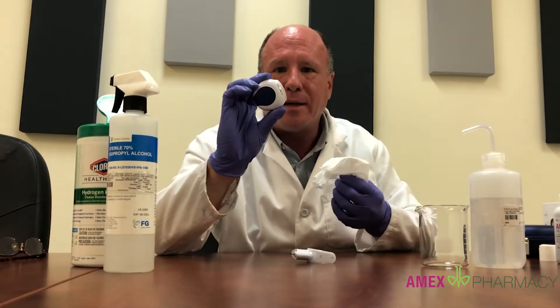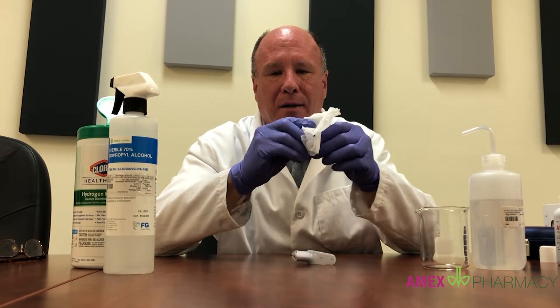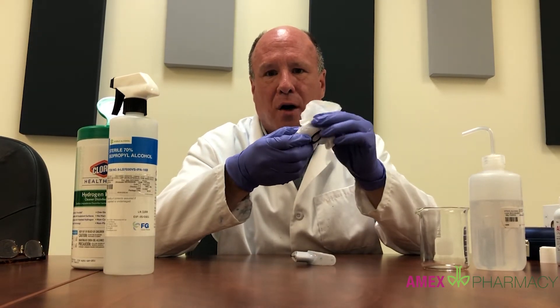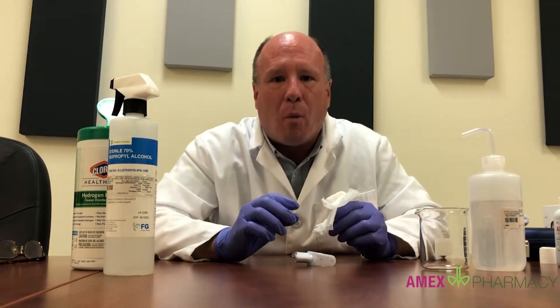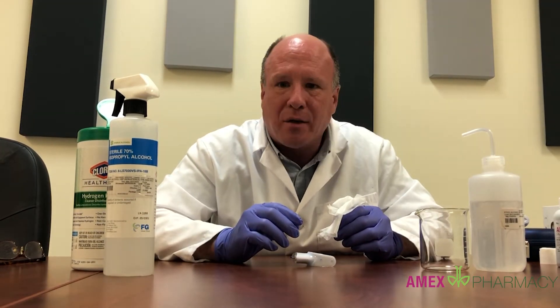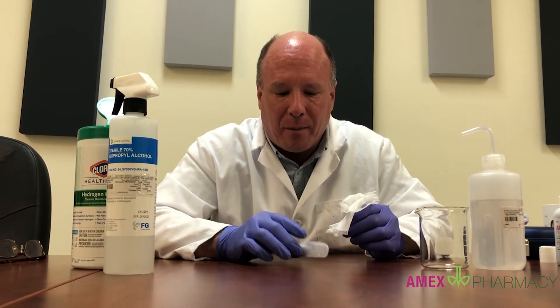We don't recommend using bleach to disinfect this product because it could damage it, but the peroxide wipes are fine. Simply wipe it down with the peroxide wipe and set it aside to dry, or put it on the charger in a safe place. I wouldn't recommend getting the battery pack wet since it has battery parts in it — a wipe is best for that.